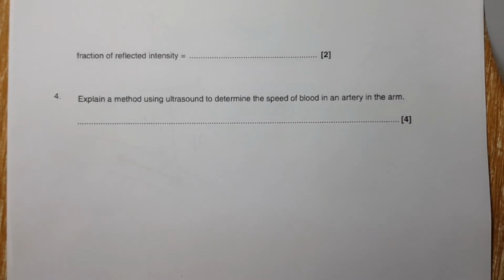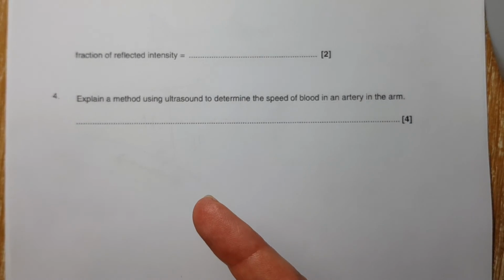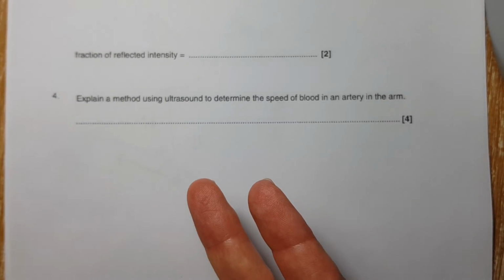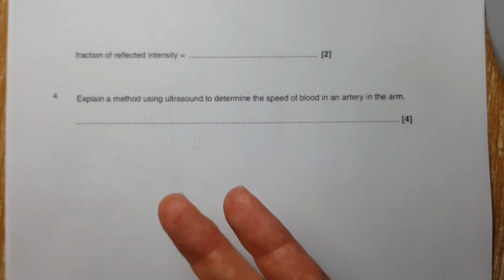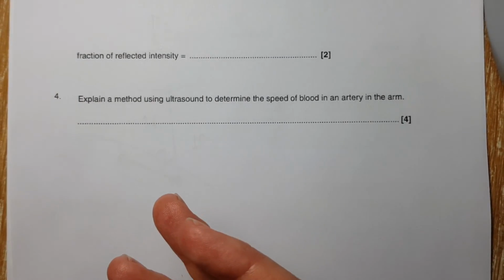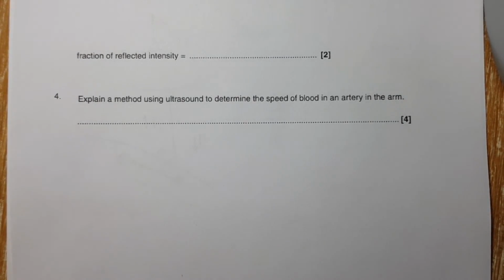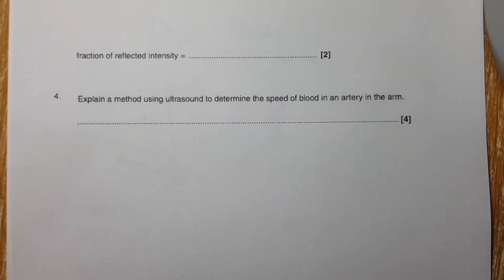Number 1, you place the transducer at an angle to the artery. Number 2, you send ultrasound pulses in, and these are reflected off the blood cells. Number 3, the frequency of the reflected wave is different to the original frequency. And number 4, this change in frequency allows you to work out the speed of the blood. And if you put the formula, that's great, but you will need to say what everything in it stands for, apart from the angle. They let you off with the angle.